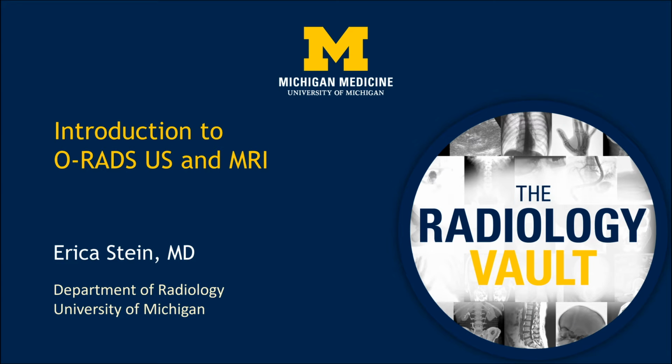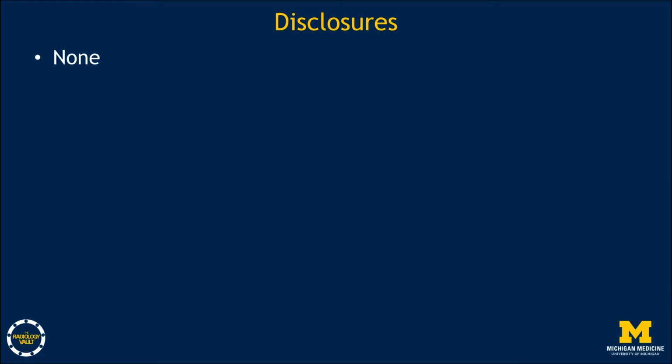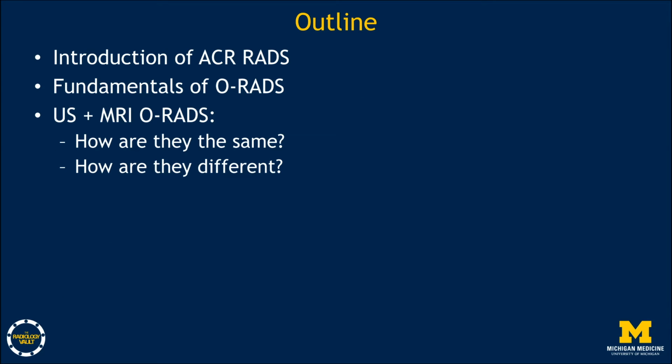Hi, my name is Erica Stein, and I'm an abdominal radiologist at Michigan Medicine. I have no disclosures. Here's an outline of what we will cover in this talk. We will briefly touch upon the ACR-RAD systems, review the fundamentals of O-RADS, and then discuss O-RADS ultrasound and MRI in more detail. How are they similar and how are they different?